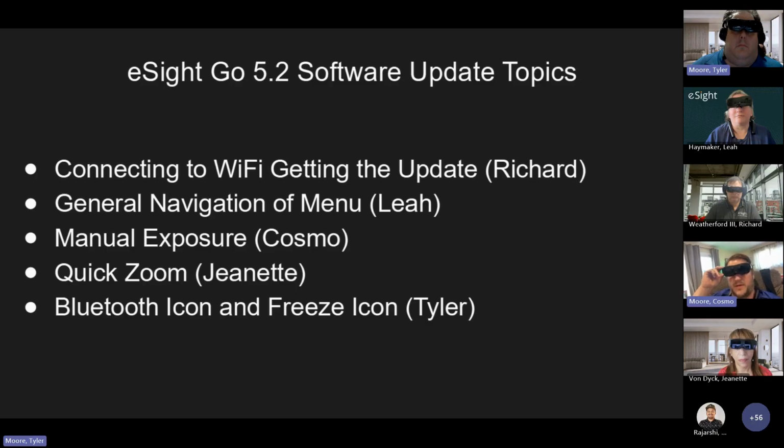Contrast, color filters, volume, exposure. So right now we're on auto. If I'm in my living room with the lights on and I were to go into my home office where it's dark, the auto exposure would raise the exposure to let more light in, and it would let me see better.